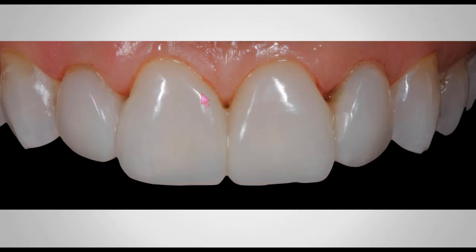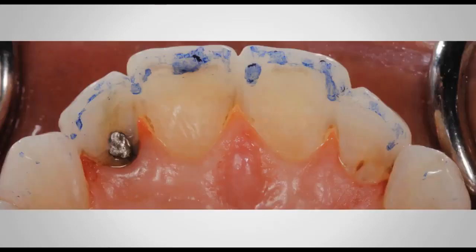Again, this is immediately after getting that little diamond burr around the gingival margins, getting to the embrasure areas. You can see I've created enough space for me to get one of those soft picks right in between the embrasure areas. Everything from 7 to 10 is connected together. They're not going to go anywhere. And now they're polished and the patient is ready to go. We make one, this is the occlusal exam right after the delivery of the prototype.